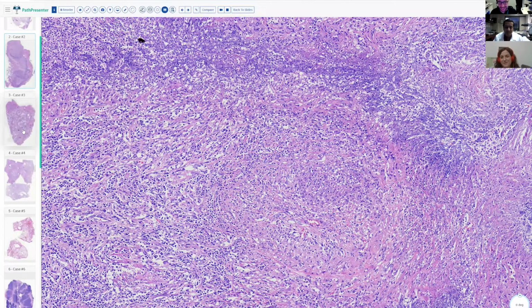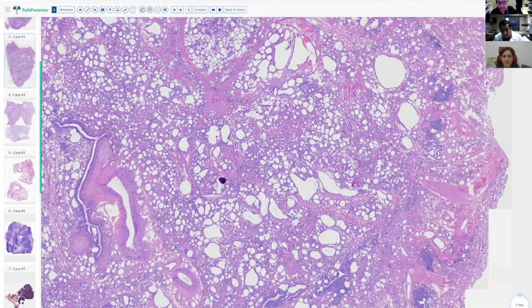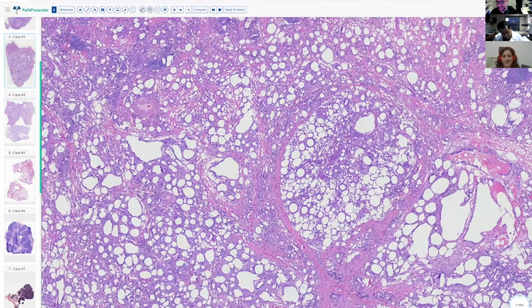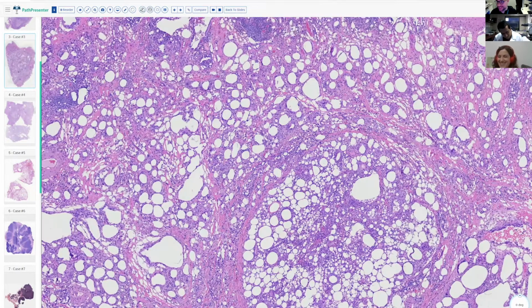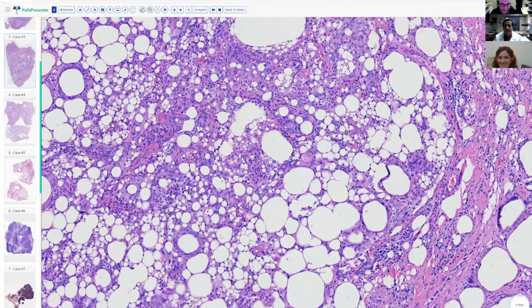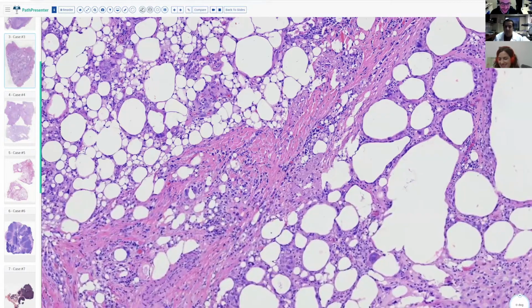But yeah, great. Okay, so moving on to the next case here. We have another surgical wedge biopsy. We're going to say this one's from a middle-aged man who has an interesting occupation; we'll leave it at that. So moving around at medium power here, we see all this stuff here, all these cells like this, as well as in the interstitium.